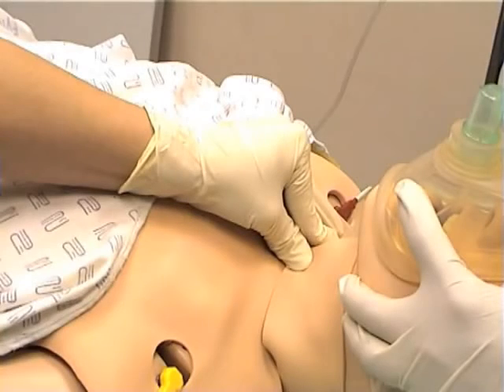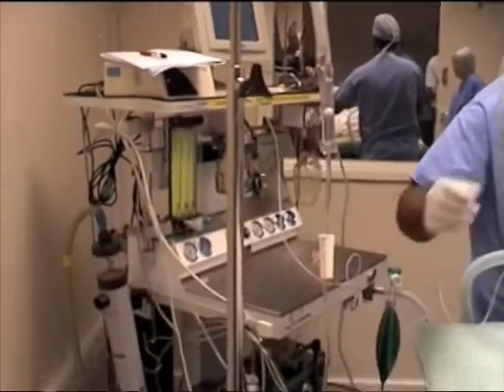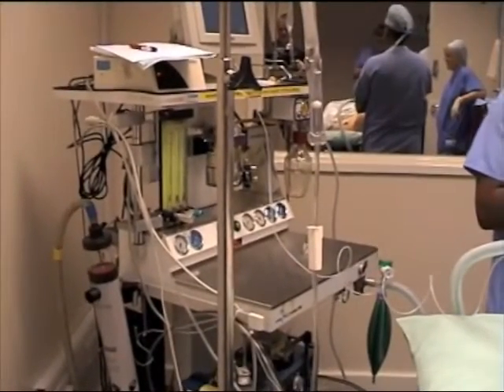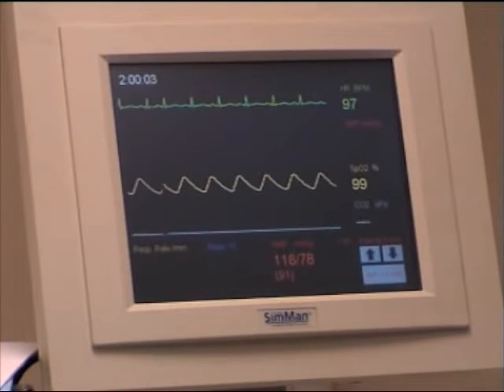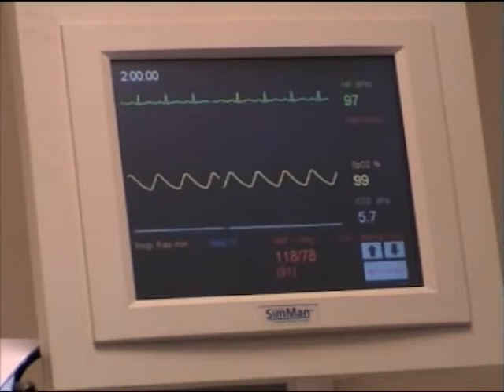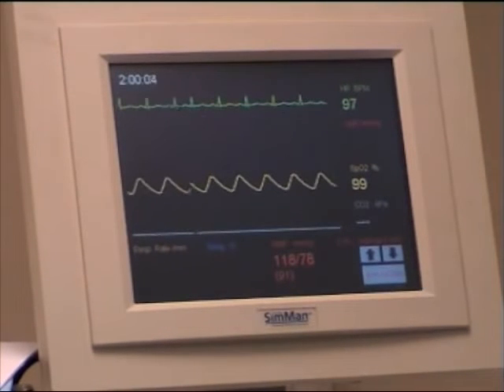The procedure should be explained to the patient, including the application of cricoid pressure. Place a pillow under the head to optimize the intubating position, establish venous access and a good flowing IV drip, and establish the monitoring, which should include pulse oximetry, a means of measuring blood pressure, ECG, and capnography for measuring end-tidal carbon dioxide. Also ensure that the trolley could be tilted head down.